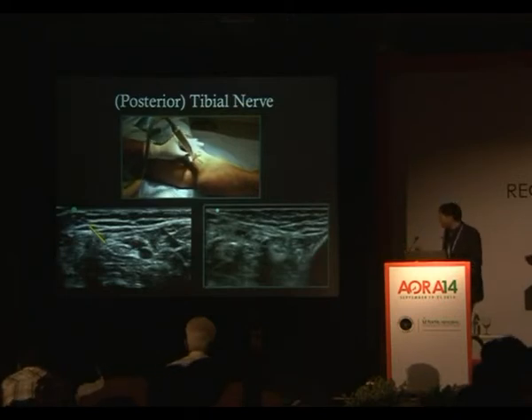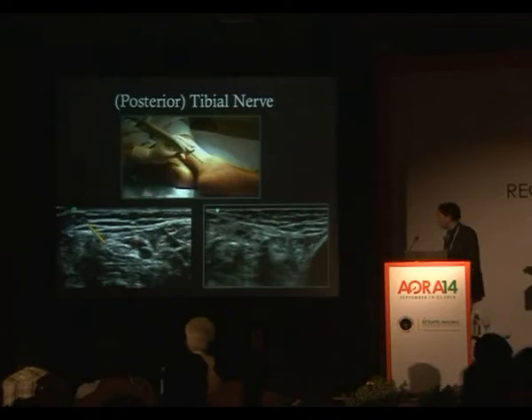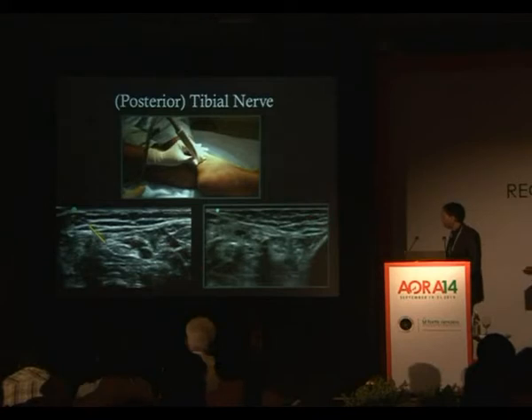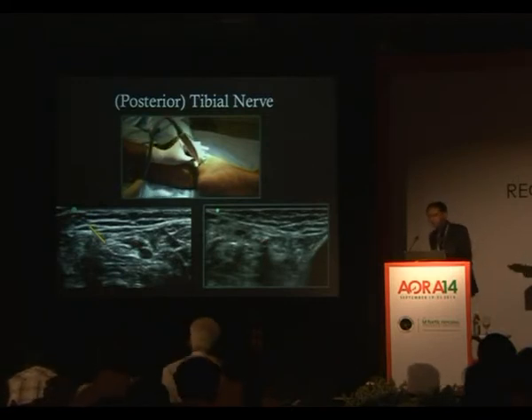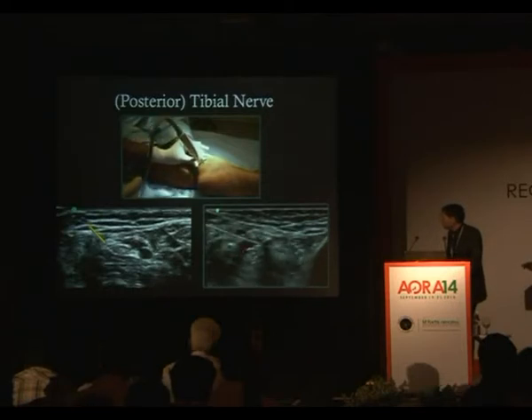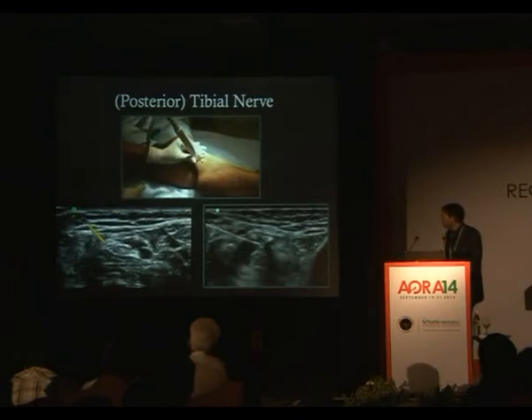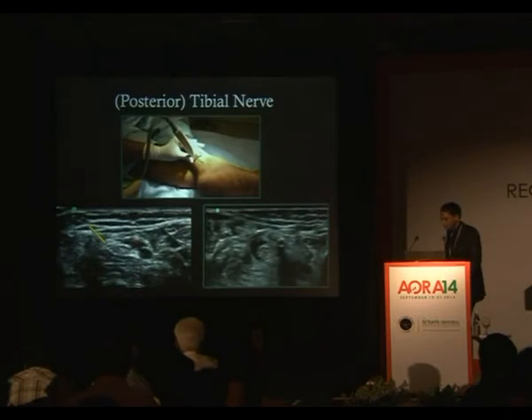Now if you just look, like Dr. Kamaka was saying in the morning, this is actually my ankle. It's pristine. But when you're giving an ankle block, you don't get the prettiest ankles around. So you get a picture which is really edematous. This patient had peripheral vascular disease. The posterior tibial artery is right over here. It doesn't even pulsate very well. But you can get over it in this block because the nerve is really large. So you can see the injection happening here. There's a needle there, a bit of fill around the nerve. So this is the tibial nerve that you have there. You can see there's absolutely just a little bit of pulsation there, not a very good leg.